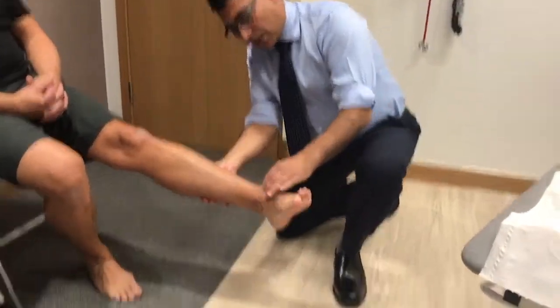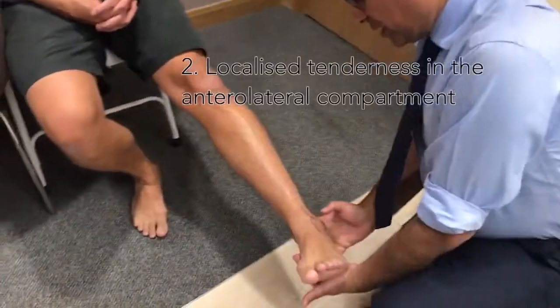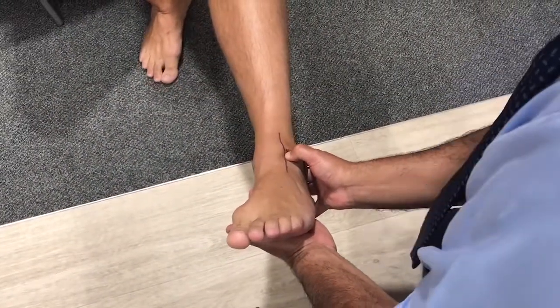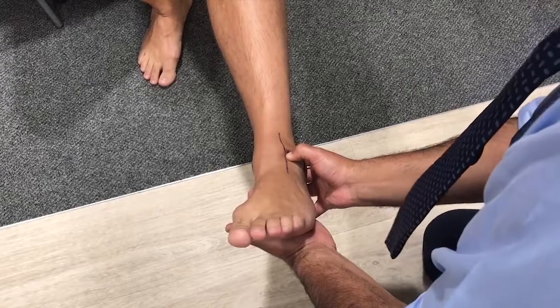This is the lateral aspect of the ankle, and the tenderness is localized in the anterolateral compartment.